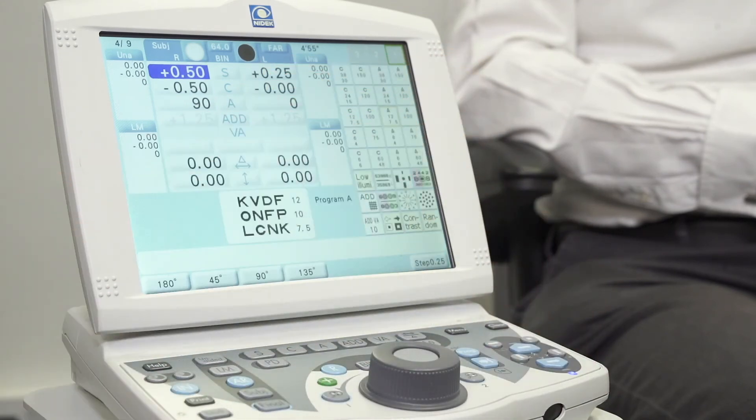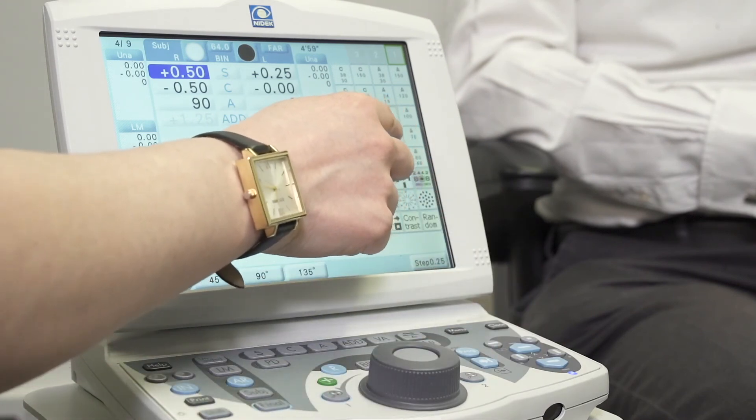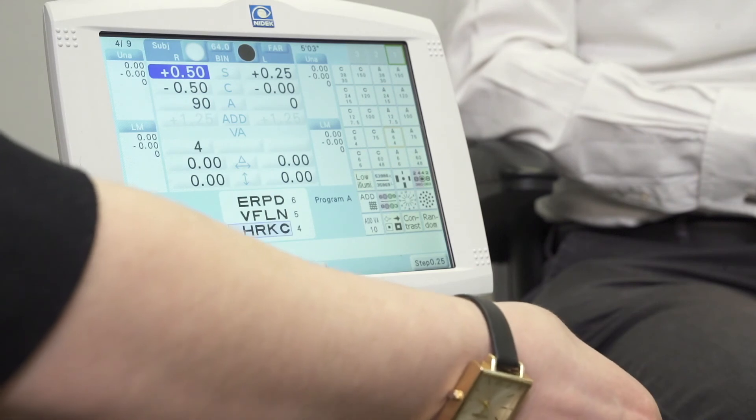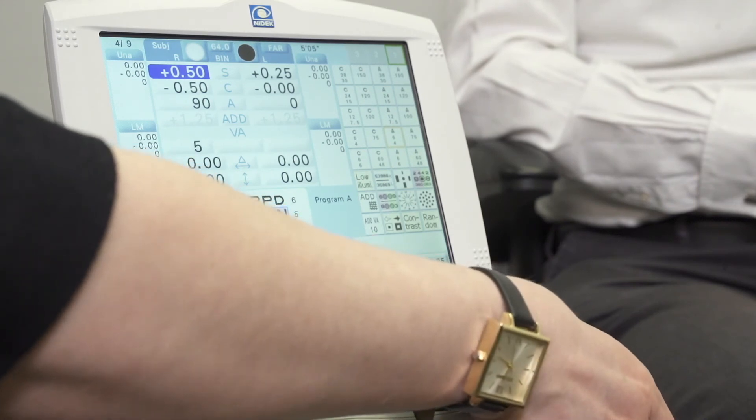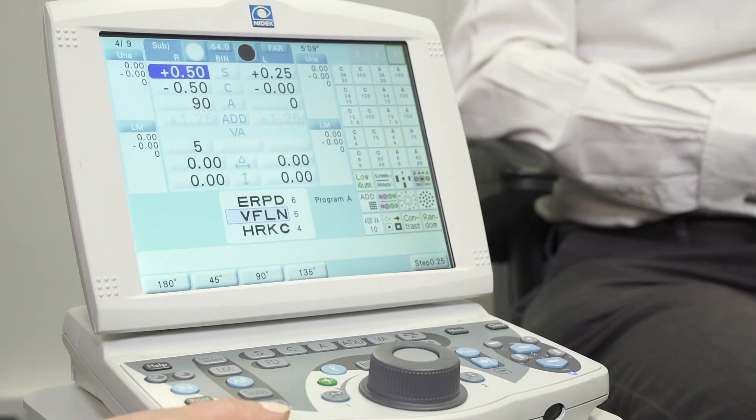Finally, we can come back to the letters, hopefully improving on what we had initially and getting the patient to read a little bit further down the chart. Selecting individual lines using the arrows just here will record as a VA just here. Once we're happy with the first eye, we can move over to the other eye and repeat the process.